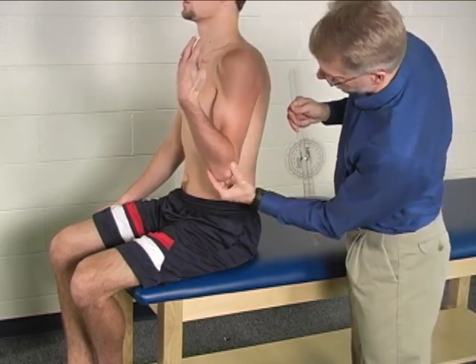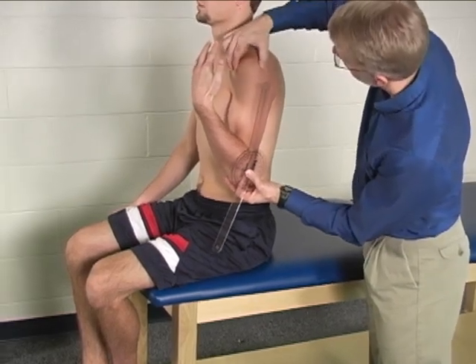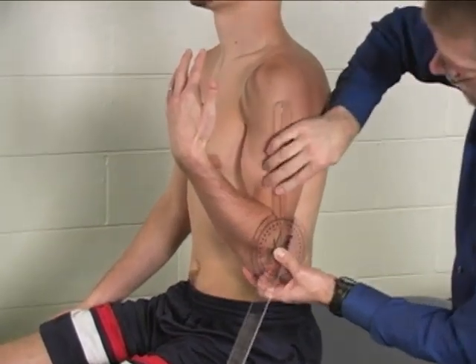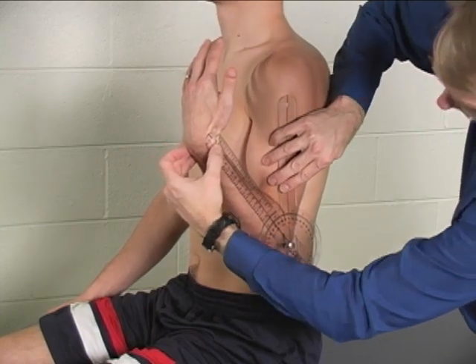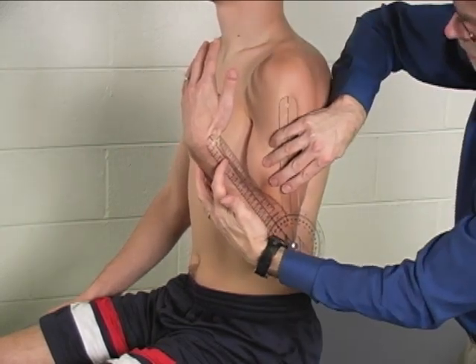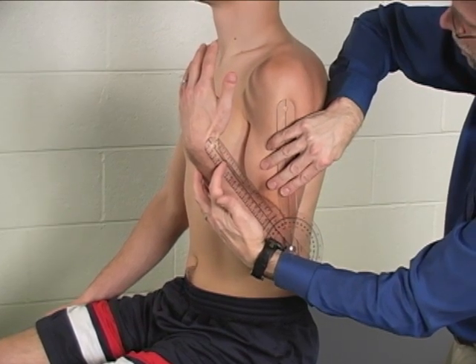Then you can re-palpate, find that lateral epicondyle again. Find that head of the humerus again for the stationary arm, right about there. And find that radial styloid again. In this case we have about zero to 140 degrees of elbow flexion.